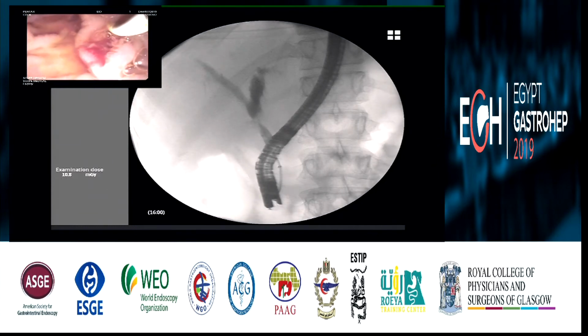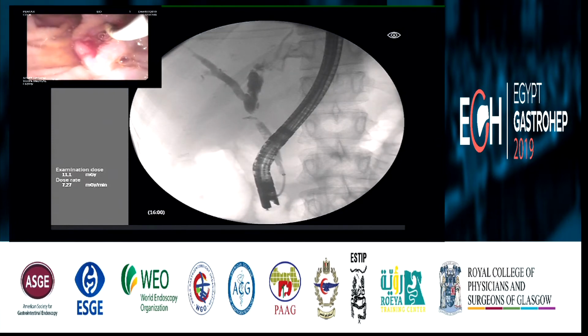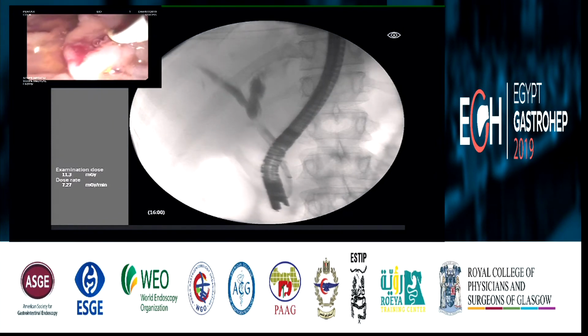Can we have one zoom of this on the screen of fluoroscopy? Zoom, zoom. Make it bigger. Zoom in. Make bigger the bile duct.